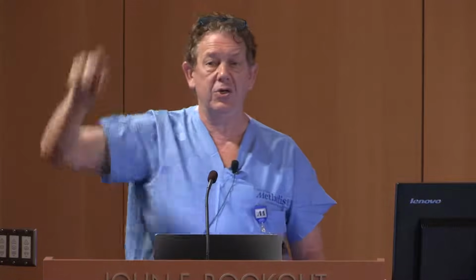Typically, you're going to put a sheath in the iliac system. You make a decision whether you inject retrograde. What that means is you've got a sheath in the groin, and you have to push it in pretty hard in order to get it to reflux up to the aorta. And if there's a tight stenosis, it isn't going to get into the aorta. It stops at that stenosis. You may be lucky and actually outline the pattern of the stenosis, but a lot of the time, you can't see the top end of the stenosis.